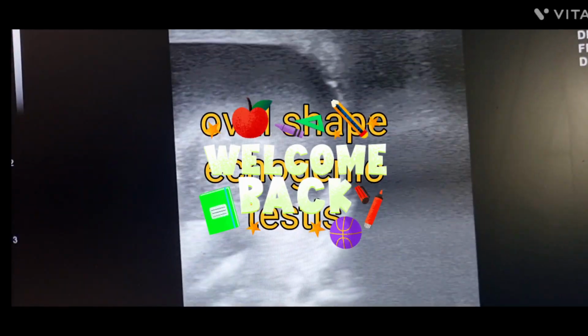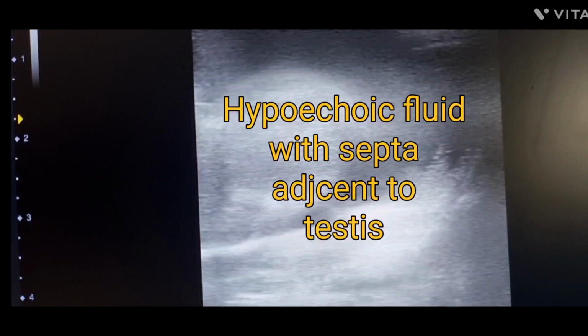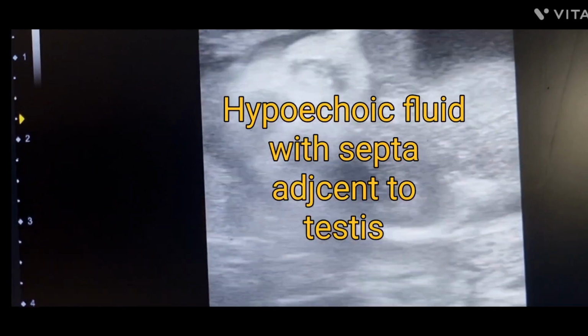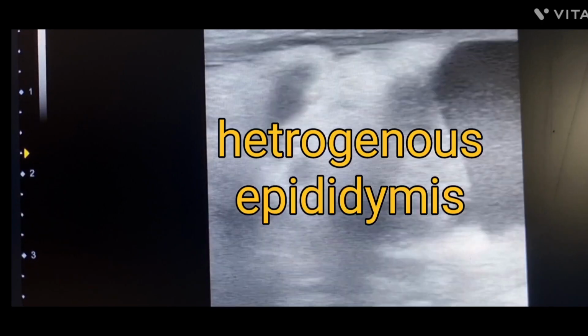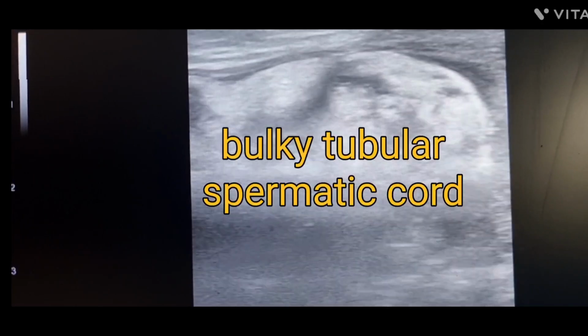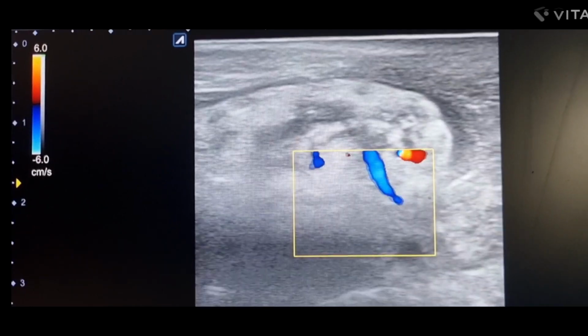Today we are going to see male scrotal ultrasound that includes spermatic cord, epididymis and testis. Today in OPD, a 46-year-old patient, of course we are talking about a male patient, came to OPD with a complaint of pain in the groin area since 12 days.